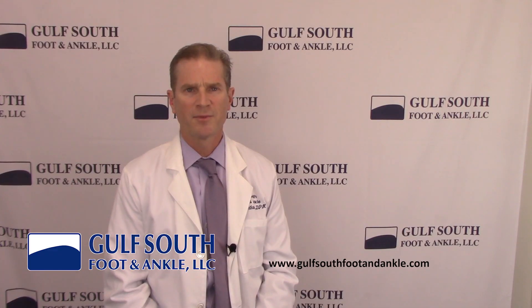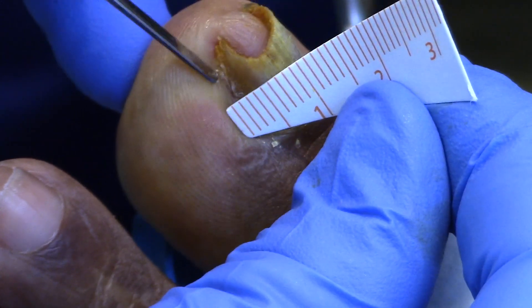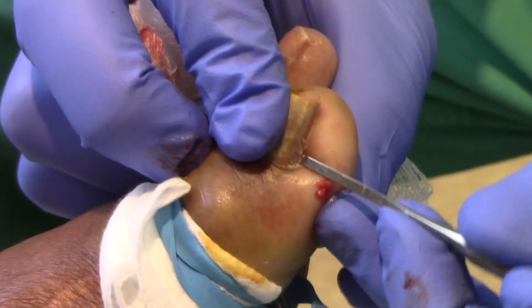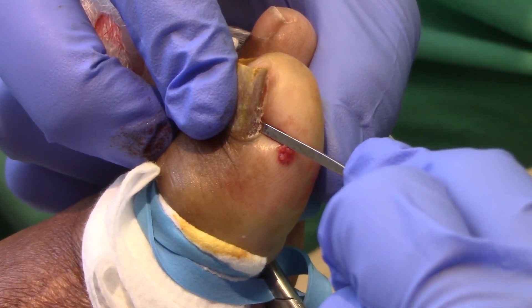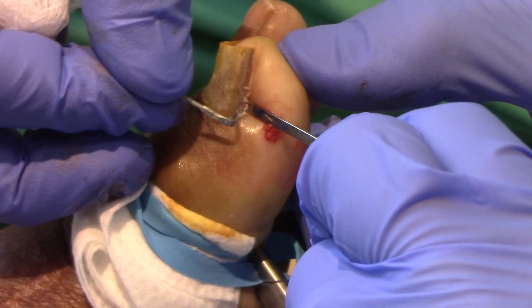Next, we take a small measuring tape and measure the width of the toenail. It's important to measure the correct width because this will determine which size KD device is applied to the toenail. To appreciate the full width of the nail often requires pulling back some of the soft tissue from each side of the toenail. Now it's time to apply the KD device. A small space is created under the nail plate as far approximately as possible, which will serve as an entry point where the KD device will attach to the side of the nail.